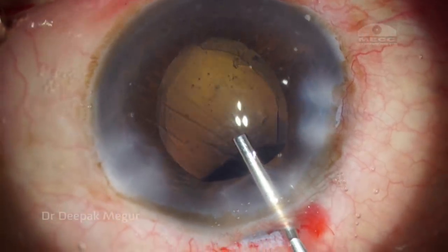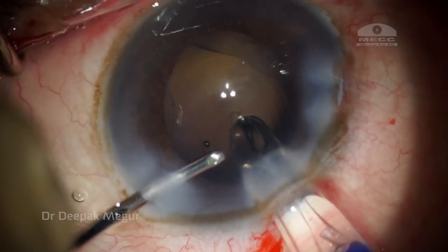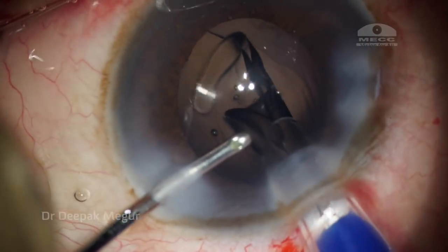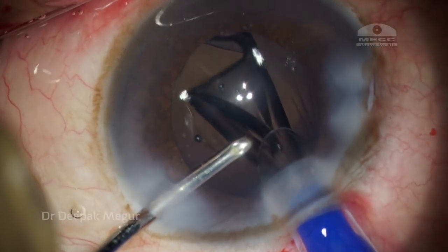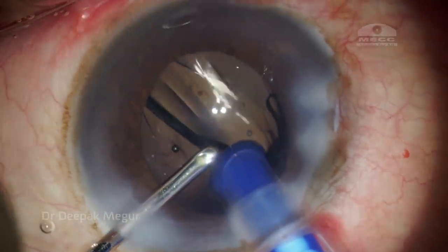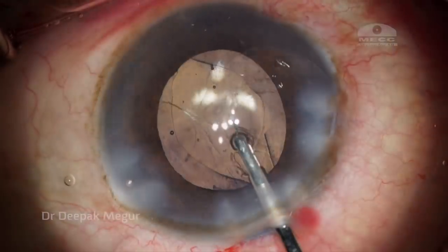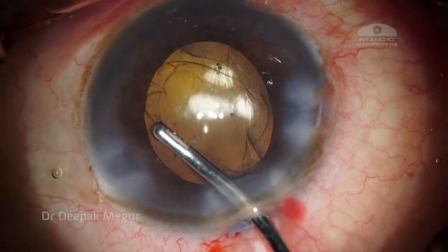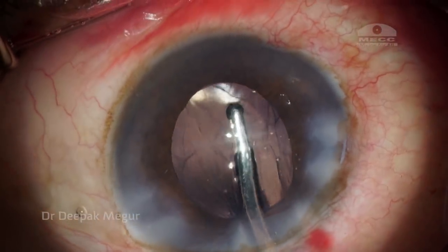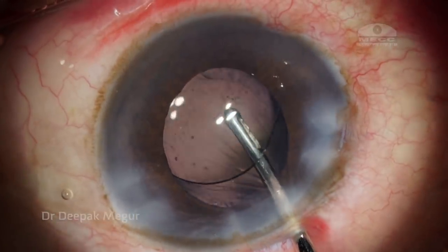So I'm using HPMC to form the anterior chamber and the capsular bag and then I'm implanting the IOL. This is a single piece hydrophobic lens. It is an AuroView lens from Auro Labs. The lens is then gently dialed into the bag and I take care to remove most of the OVD which is there both in front and behind the intraocular lens.